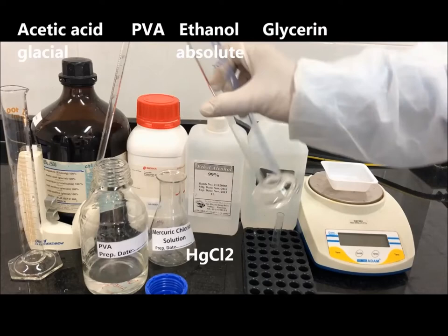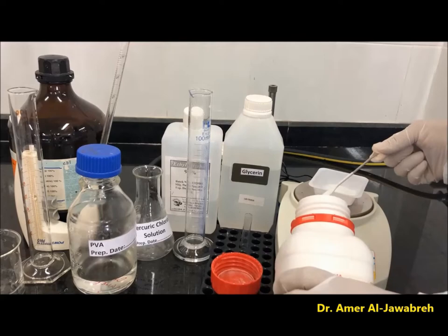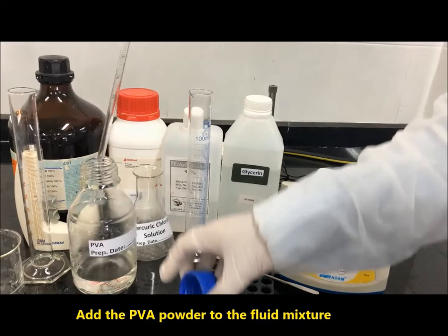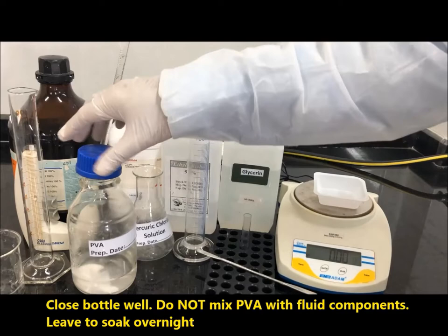Weigh 5 grams of PVA powder and add it to the fluid mixture. Close the bottle well; do not mix PVA with fluid components — leave to soak overnight.